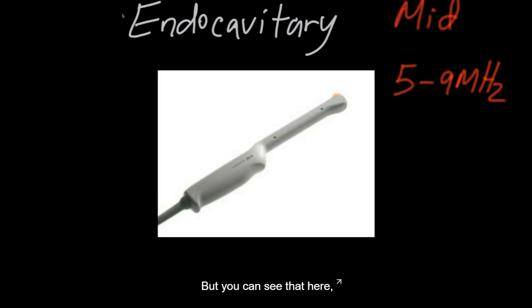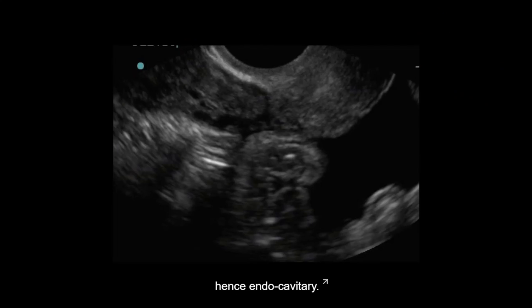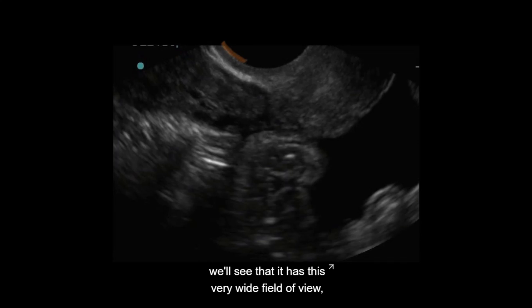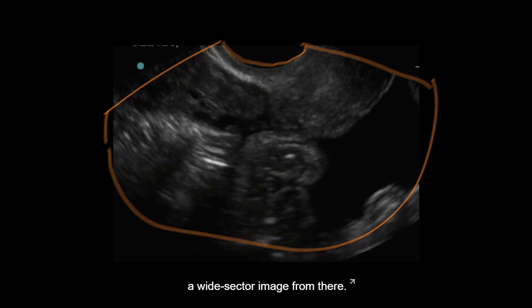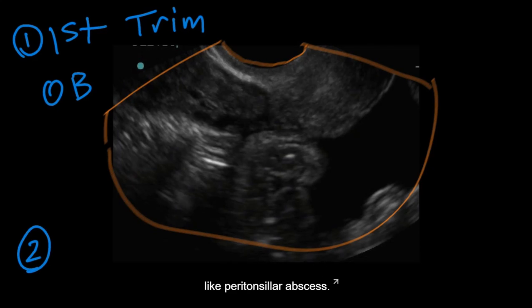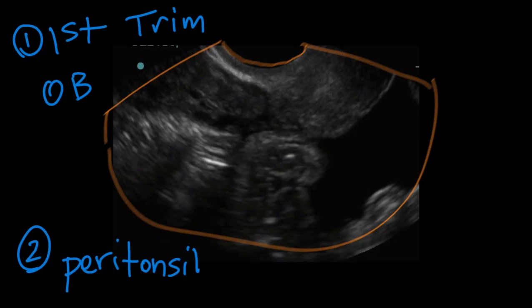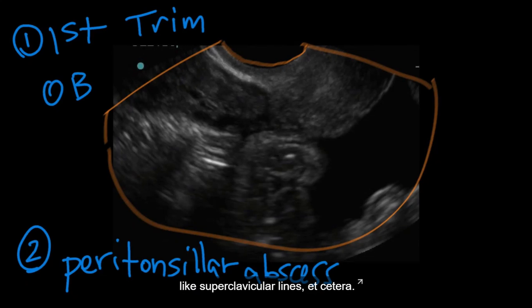But you can see that here, the footprint is near 180 degrees. So it has a very wide field of view. The shape of the probe is so that it can get into cavities, hence endocavitary. And if we look at the shape that the endocavitary image produces, we'll see that it has this very wide field of view, nearly 180 degrees, and then produces a wide sector image from there. Now, primarily, as we discussed, this is used in first trimester OB, but you can also use it in other applications like peritonsillar abscess. I've seen it used in certain vascular applications like supraclavicular lines, etc.